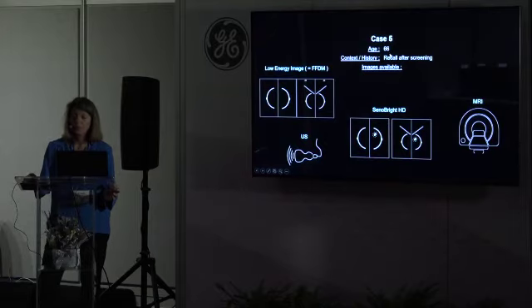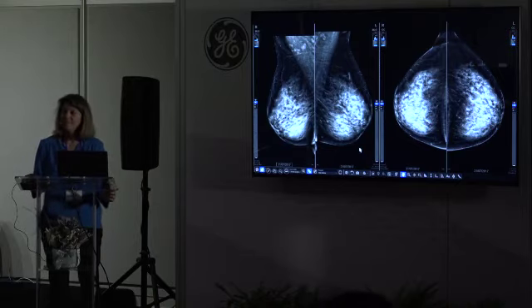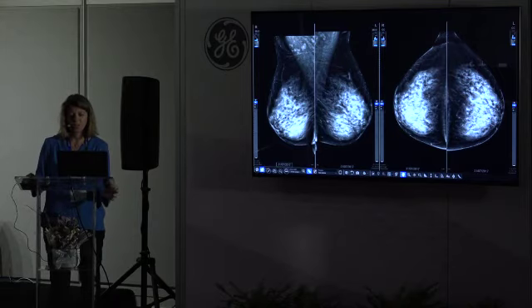Last case, this patient is 66, and it's a recall after screening. And very dense breast also. Do you see something? Right, left, you can stop me. Here? Here? Yeah, maybe. It seems there is a little bit of distortion, but I'm not really confident. But finally, she was recalled for this, in fact, because of a small density, small asymmetry, but we are not completely sure. Nothing on ultrasound, and it could be only glandular tissue.